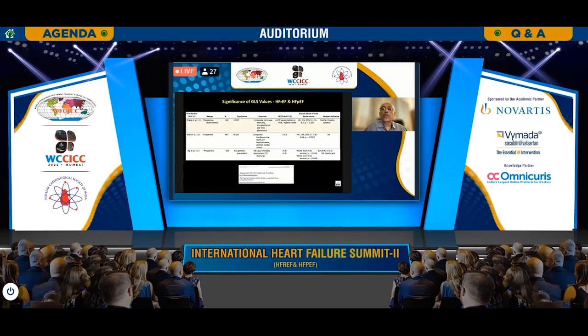And now moving on to looking at both the preserved ejection fraction and reduced ejection fractions. So these are some of the values. Again, it's a long table, so I've just edited out and shown only these three. So you have reduced ejection fraction, preserved, and then the ICD here, 400 patients, and the numbers here. So 6 and around 9.6 here for the reduced ejection fraction, and around 16 here for preserved, and then less than 10 for ICD, the ICD patients here.